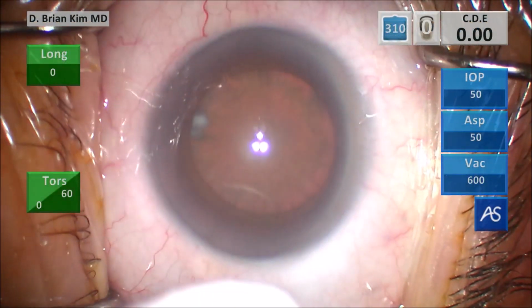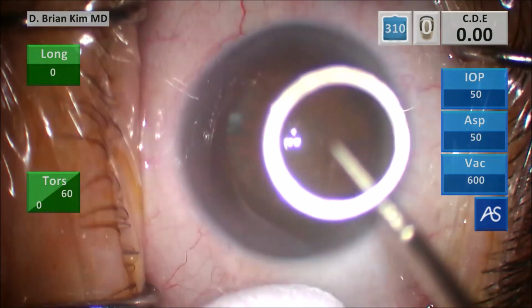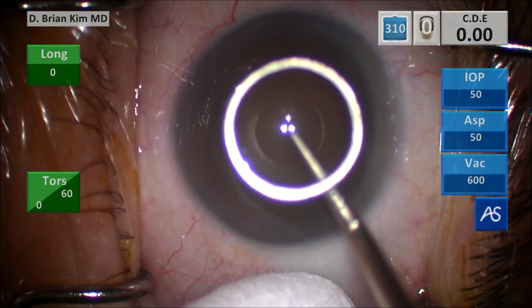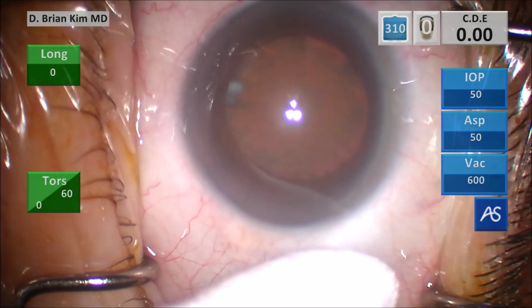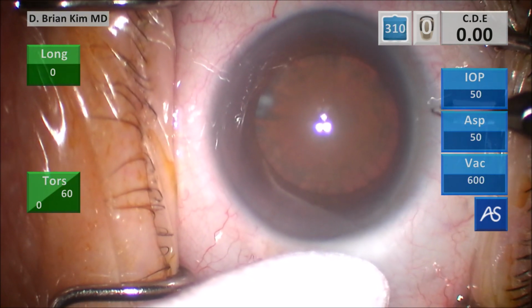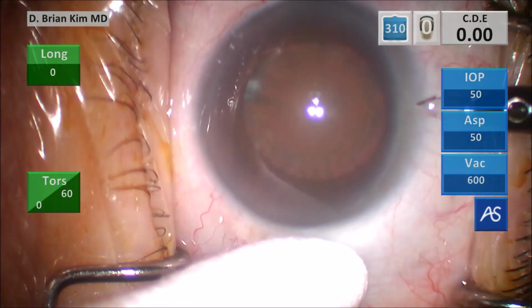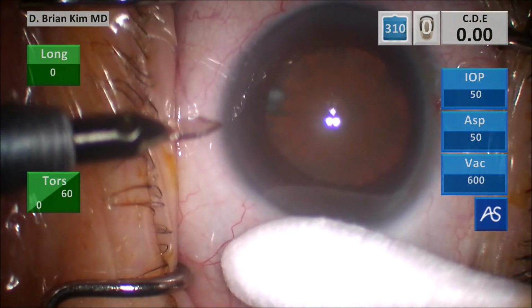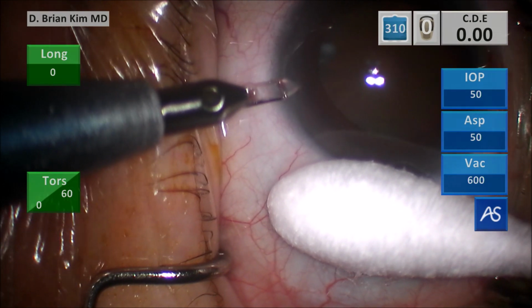So you can see this is a rather dense lens. I'm using a corneal marker, which will help me to center and size the rhexis. This is my paracentesis incision, first on the right side and then the left side, making sure I'm parallel to the iris plane using the cotton tip to control the eye. By making it parallel to the iris plane, I get a nice corneal shelf, which will allow me to achieve a self-sealing incision.